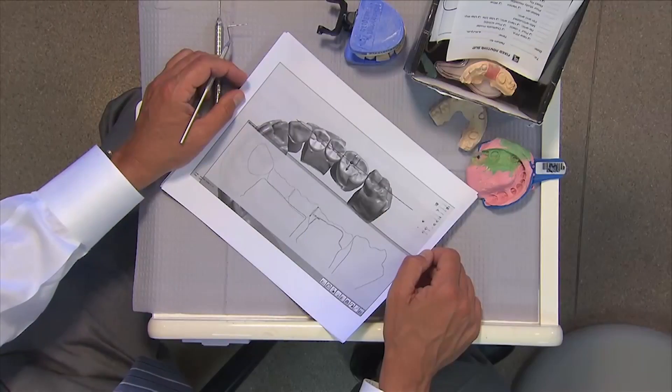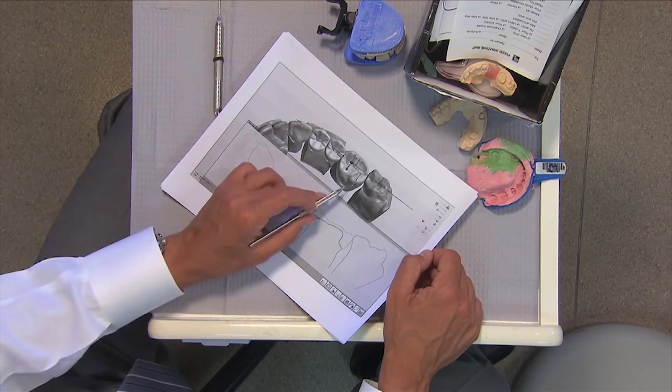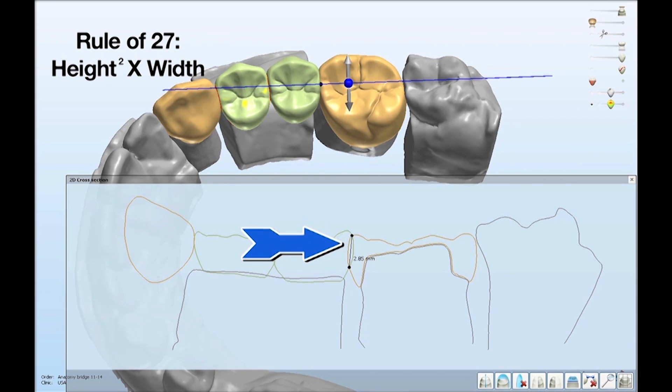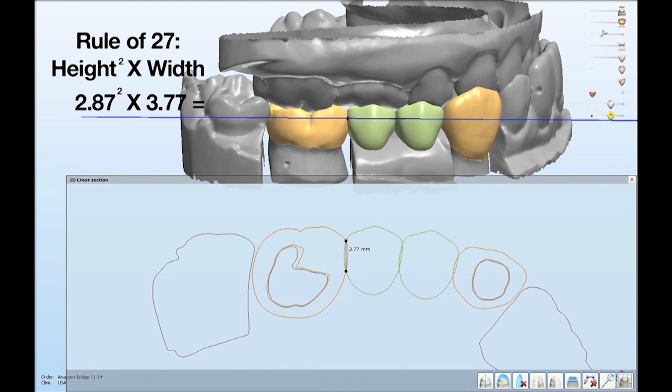Let's take a closer look once we've had a chance to scan this. We've now scanned the preparations and actually designed the bridge — you can see the design of the four-unit bridge — and that allows us to make some measurements. For example, between tooth number 13 and tooth number 14 we have a vertical height of 2.85 millimeters. The rule of 27, used in the laboratory, is as follows: you take the connector height, square it, then multiply it by the width — the buccal-to-lingual width of that connector. So we have 2.85 millimeters in vertical height, and at that area the width is 3.77 millimeters.